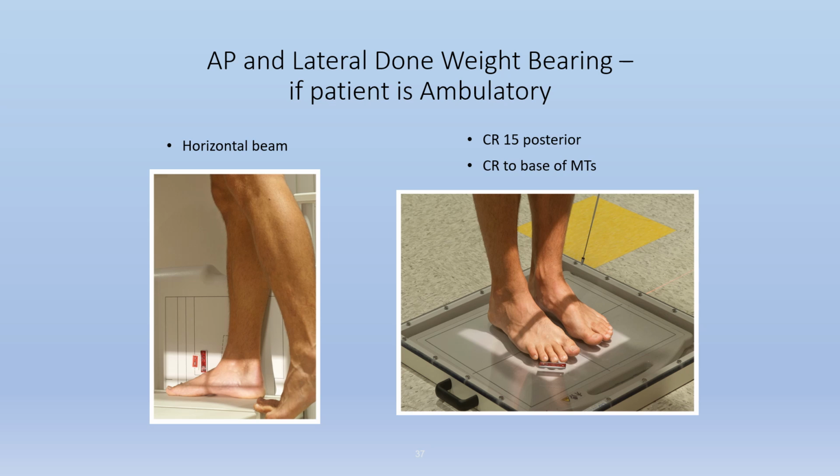Central ray is angled 15 degrees posteriorly, and if it is bilateral feet, then it's between both of them at the level of the base of the third metatarsal. I'm sorry, I'm thinking unilateral. If it was unilateral, it would be the same and be at the base of the third metatarsal. If it's bilateral, you're basically in between both feet at the base of all the metatarsals. So they're in between the bases of the metatarsals by imaging right here for this AP.